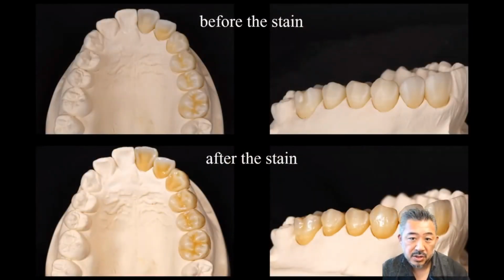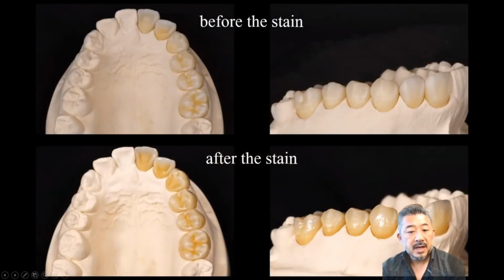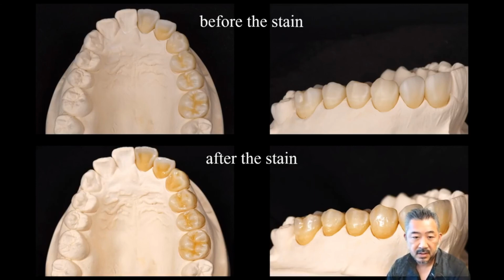Okay, here are the pictures before and after the stain. You can see the appearance has changed by external stain. In other words, it's better to keep the color tone a little weaker in the sintering stage, so that you can adjust the color tone with external stain. So if you need to adjust it, you can handle it, right? But if you want to reproduce the standard shade, you rarely need external stain. Using only glaze firing is enough.